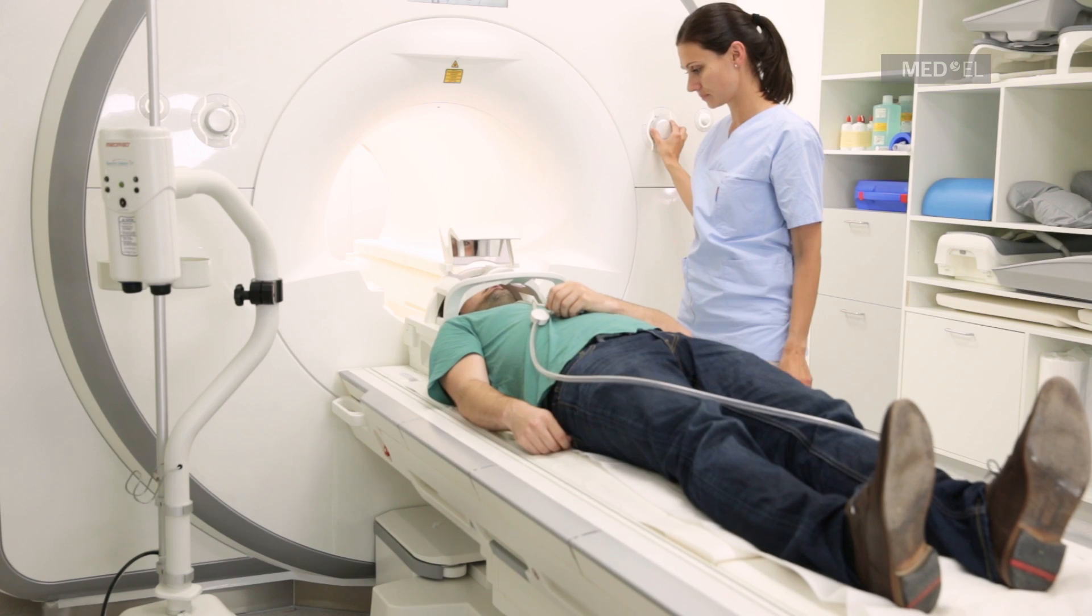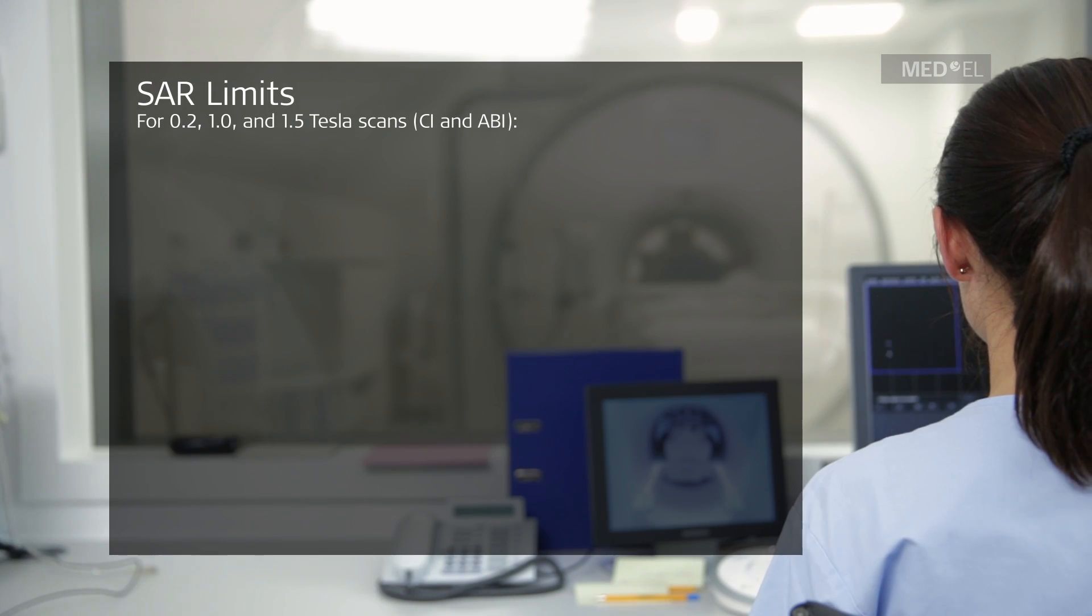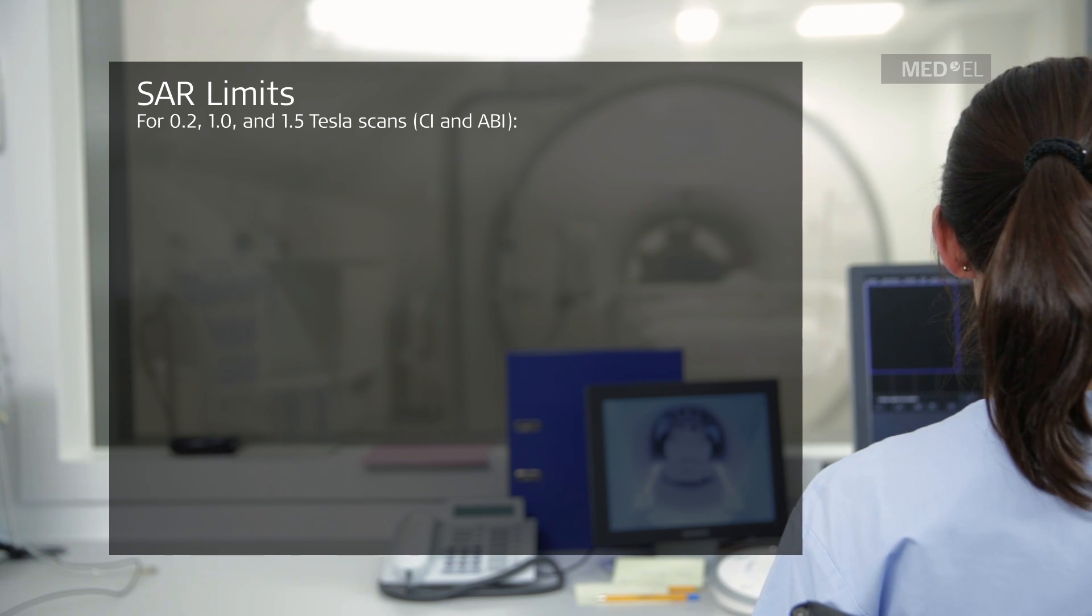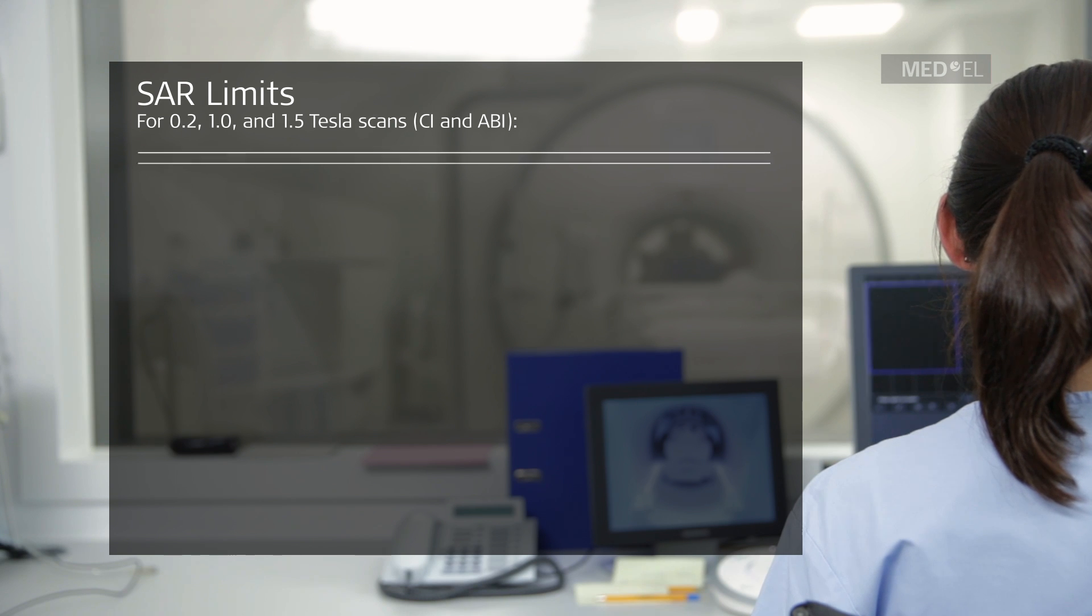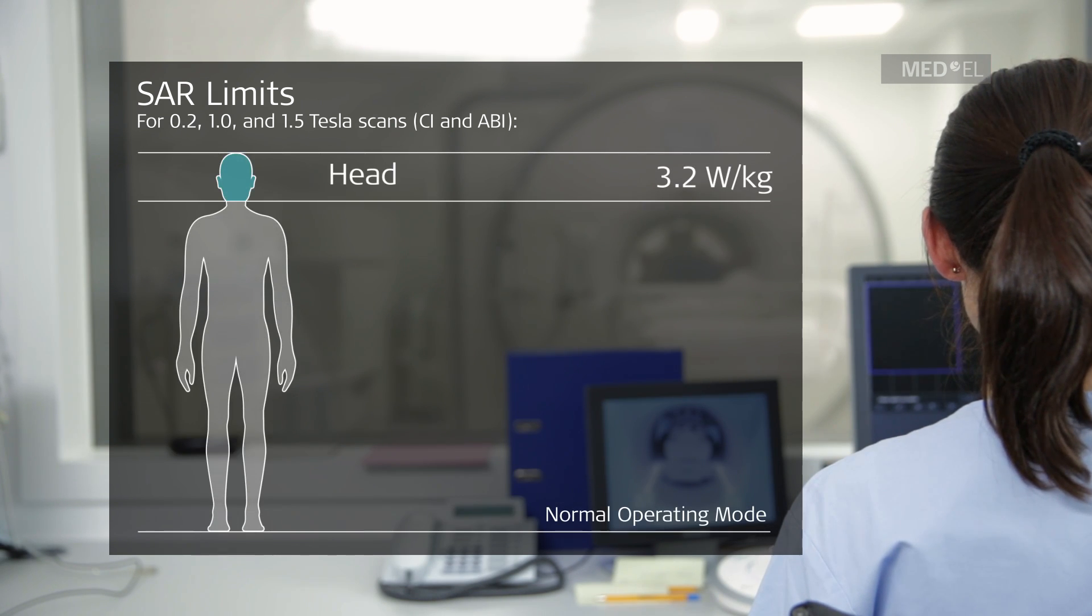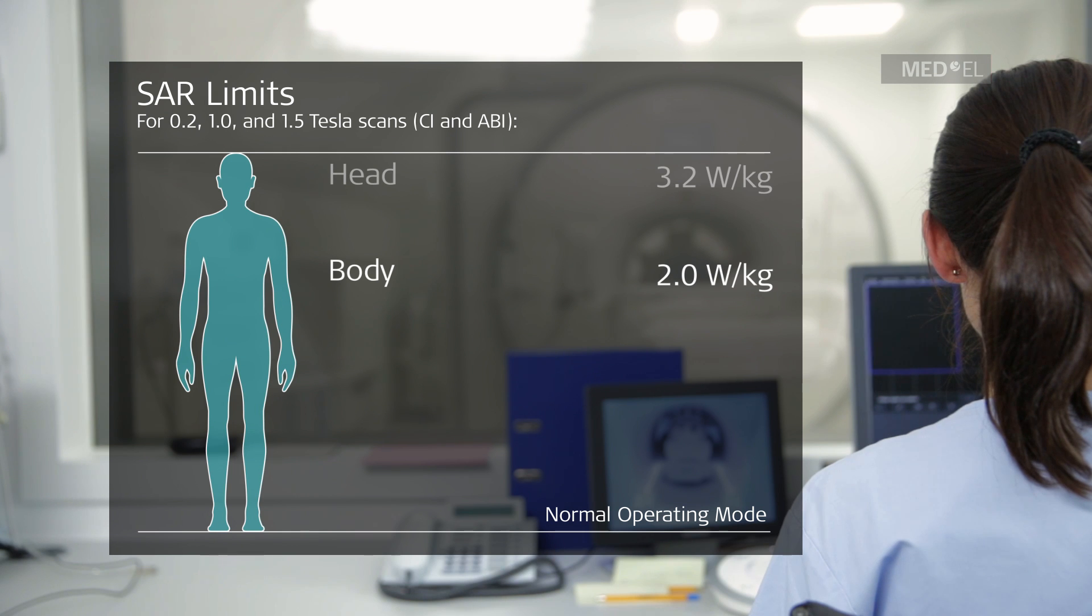Following SAR limits apply for the synchrony implant. For 0.2, 1, and 1.5 Tesla scans, run sequences in normal operating mode only. This means a head SAR limit of 3.2 Watt per kilogram and a whole body SAR limit of 2 Watt per kilogram.